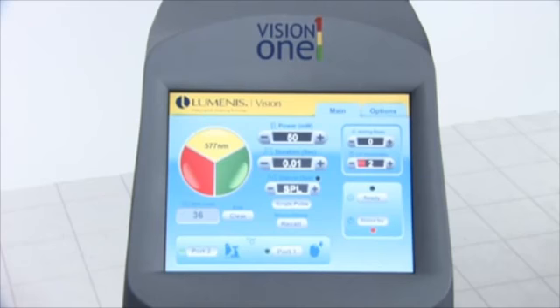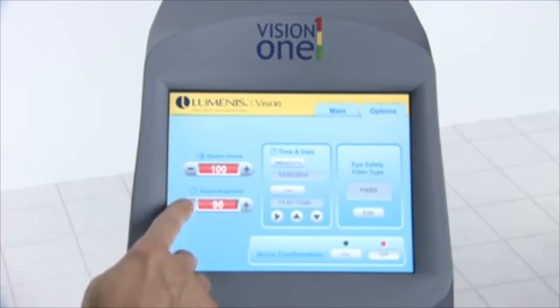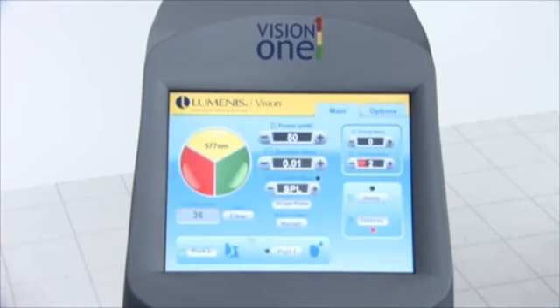To adjust the screen brightness, press the Options tab to view the options screen. Press the Plus, Increase, and Minus, Decrease selectors in the Screen Brightness field to select the desired screen brightness. Then, press the Main tab to return to the treatment screen.